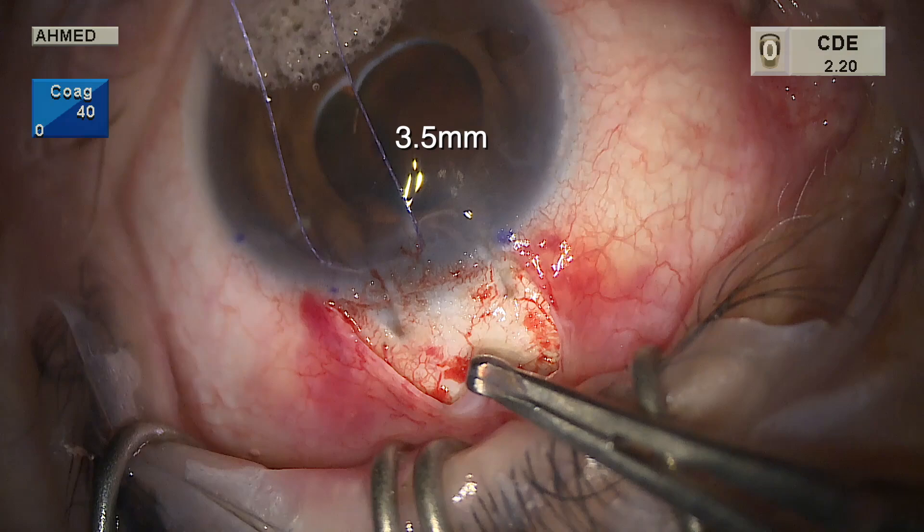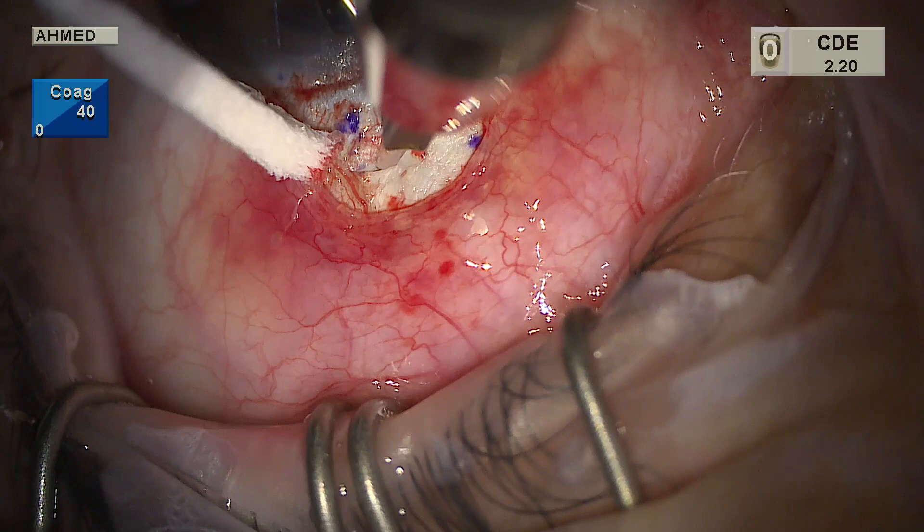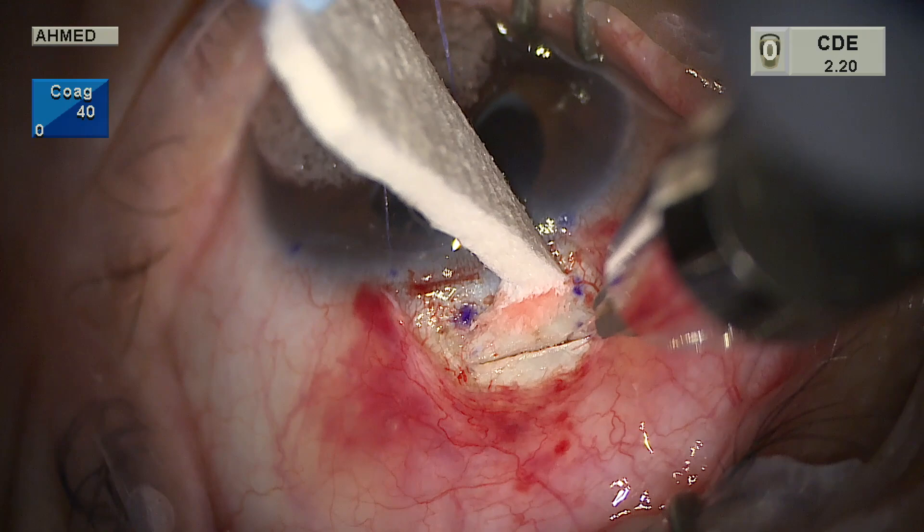The scleral flap is made 3.5 millimeters wide by two millimeters in length. We mark just at the posterior limbus at the end of the blue zone, and our flap will be 3.5 by two millimeters. A posterior incision is made at the back edge of the flap, almost full thickness — about three-quarters thickness. The scleral flap itself should ideally be at least half thickness to provide enough resistance to outflow and prevent hypotony.